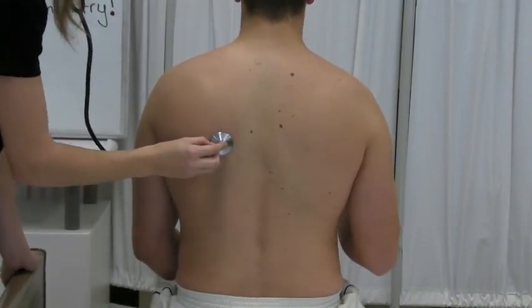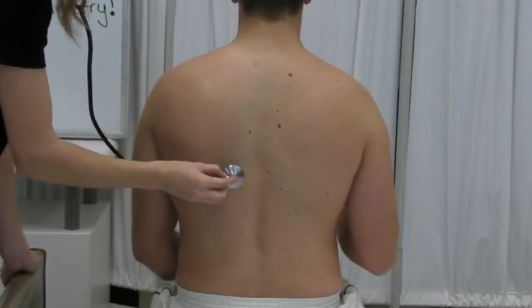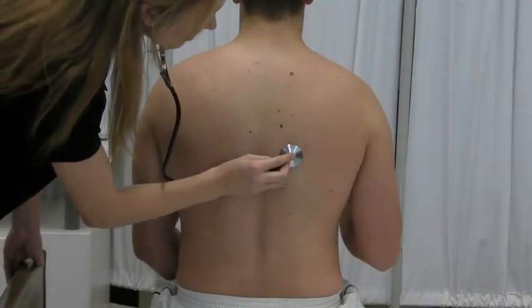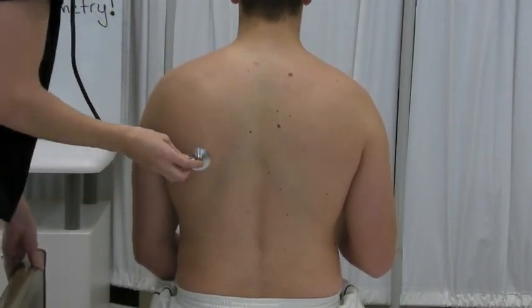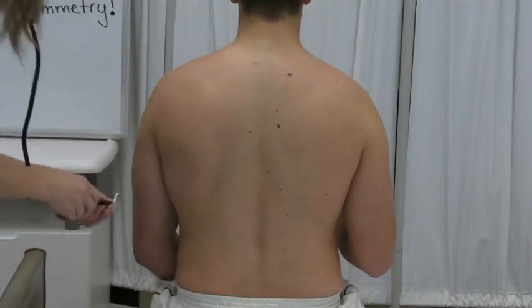Once you're past the scapulas, you can move over. Remember how far down the lungs go and try to assess all the way down to T12. And you need to assess the right middle lobe, so you can do it here also and listen to both sides.